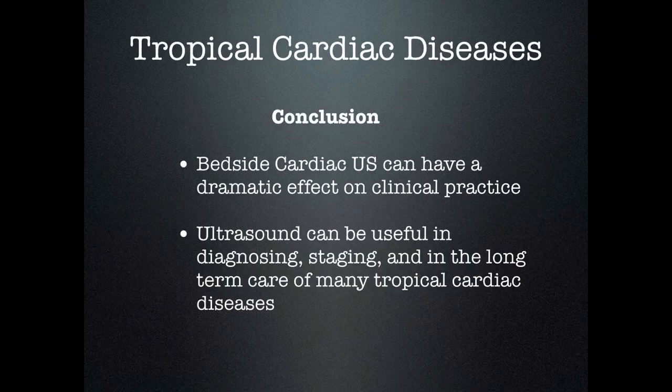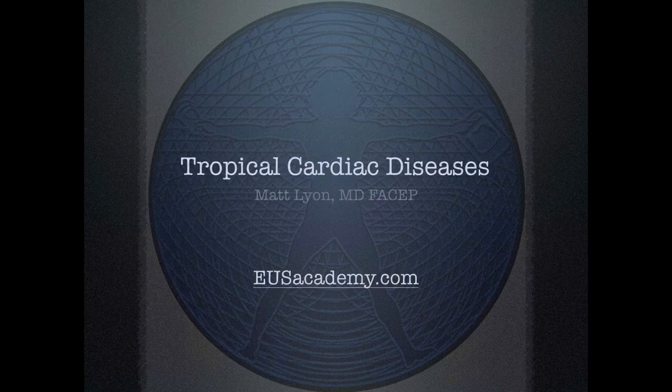So in conclusion, ultrasound can be very useful in the diagnosis of many tropical cardiac diseases. It has a direct effect on clinical practice in that it can be used for staging as well as diagnosing these diseases, and it can be used in the long-term care of many tropical cardiac diseases. Thank you very much.